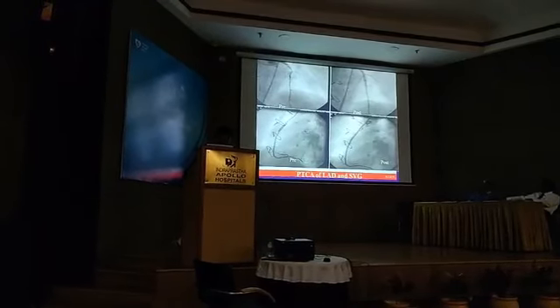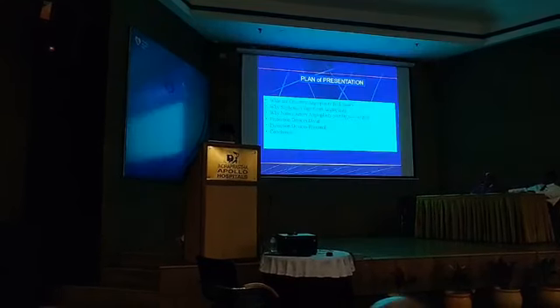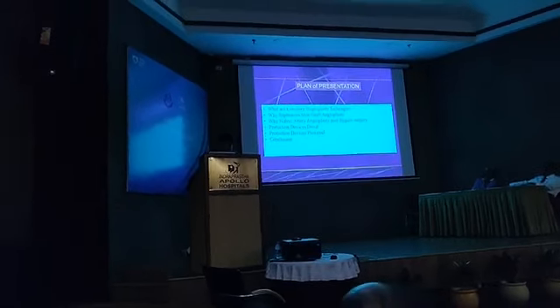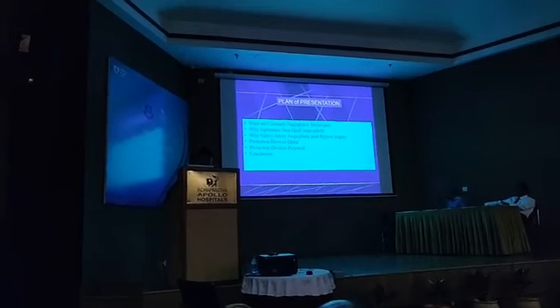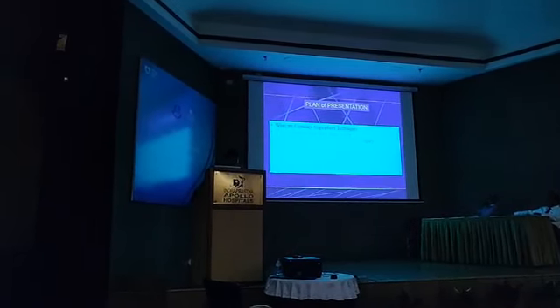These are the important things, and this is pre- and post-angioplasty stenosis here and here. So the plan of presentation will be: what are coronary angioplasty techniques, which I am not going to detail; why saphenous vein graft angioplasty; why native graft angioplasty post-bypass surgery; when to do and use protection devices, distal or proximal; and then I conclude.